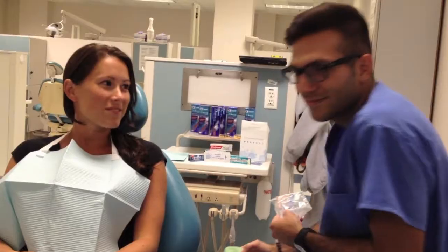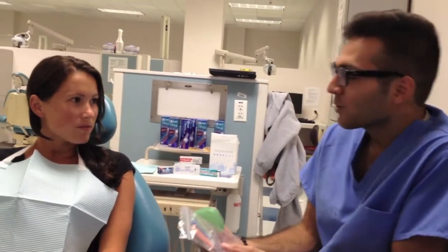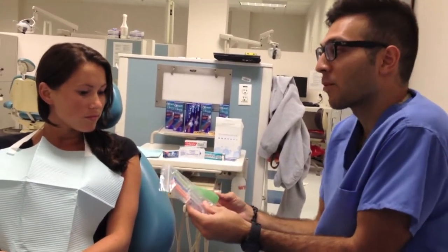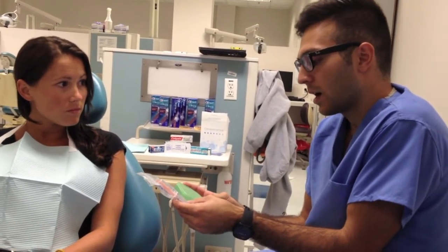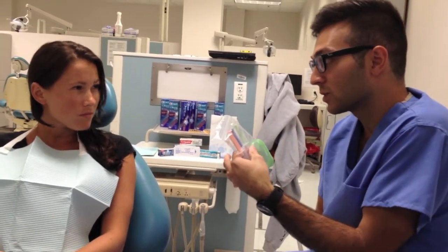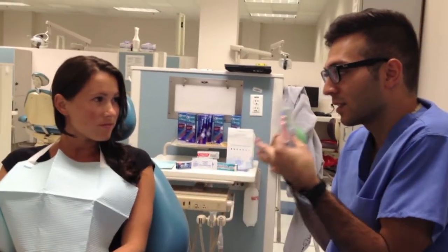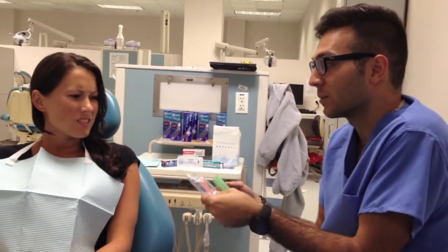Yeah. But how does it work? Generally hydrogen peroxide breaks double bonds and eliminates discoloration. But this system uses carbamide peroxide, which is a lower percentage and it's at a lower risk. Basically what happens is it's going to infiltrate the dentinal tubules, which is the part of your tooth underneath the enamel, and it's going to release the staining and open up space for the whitening material to eliminate the stains.